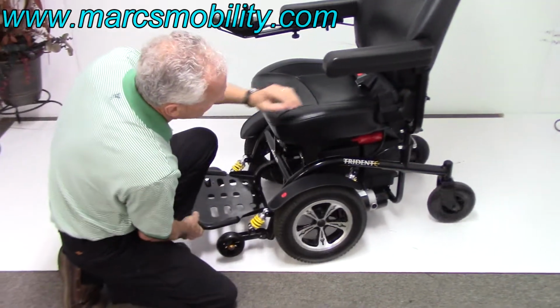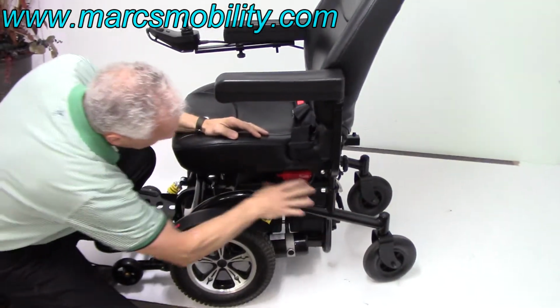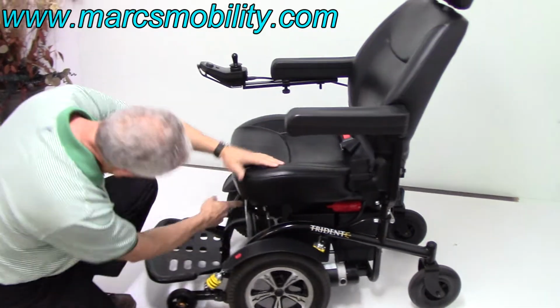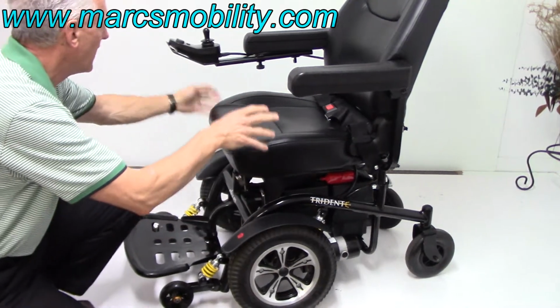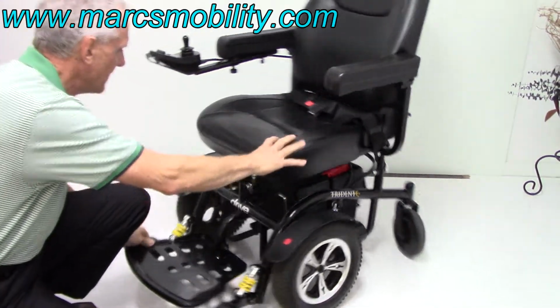And you can see also the seat is adjustable in height. You can see the levers here. There's 2 more holes, so if this seat needs to be dropped down some more, this seat can be dropped down. In the front also, you've got your levers to adjust the height of the seat. So if you need the seat lower, right now it's probably at 22 inches, and it probably can drop down to 20.